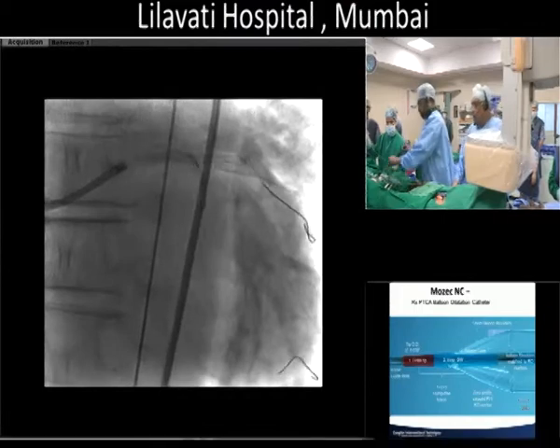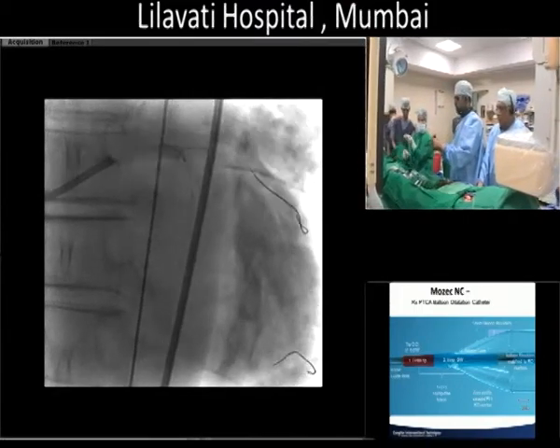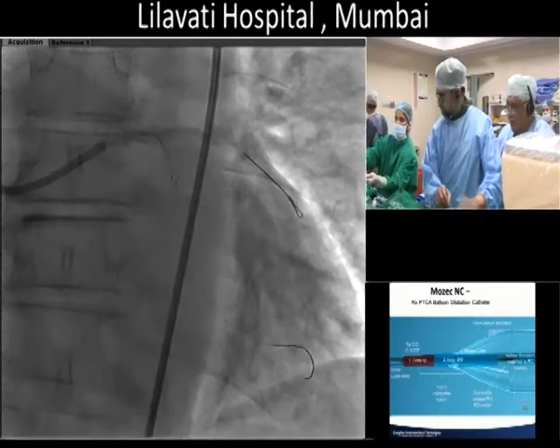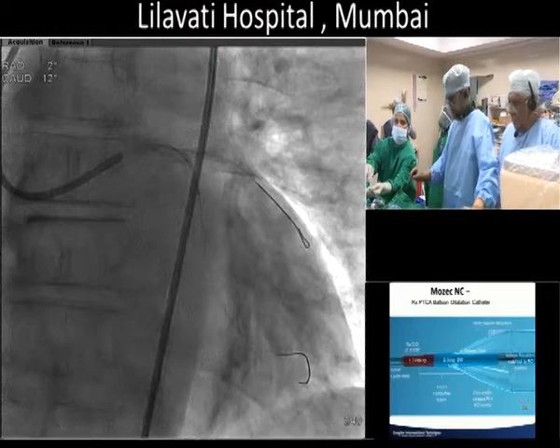Is it the technical issue? Well, it's carinal shift. It's the fact that you have a strut of the LAD across it, probably. It didn't look severely diseased when you first took your pictures.